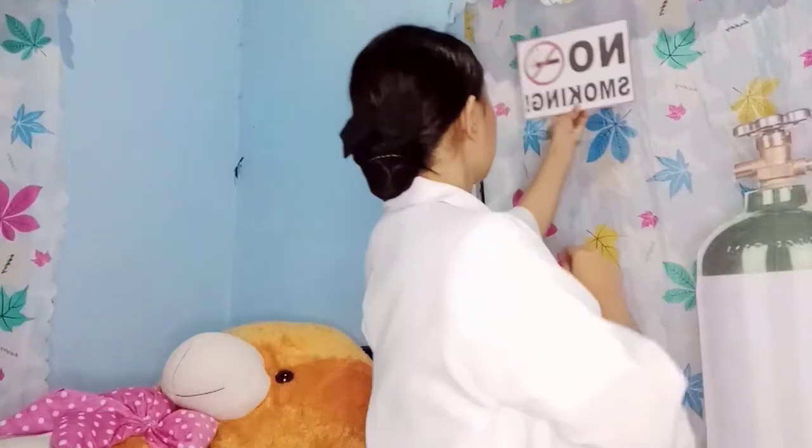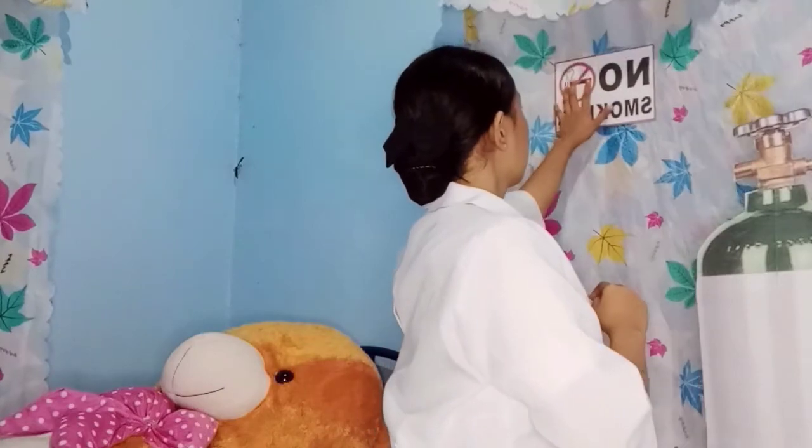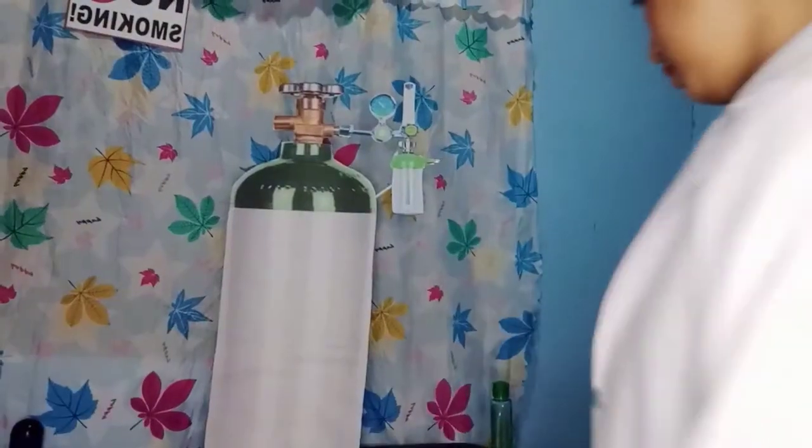Place no smoking signs in appropriate areas. And then next, attach the face mask to the oxygen source with humidification if appropriate for the specific mask.